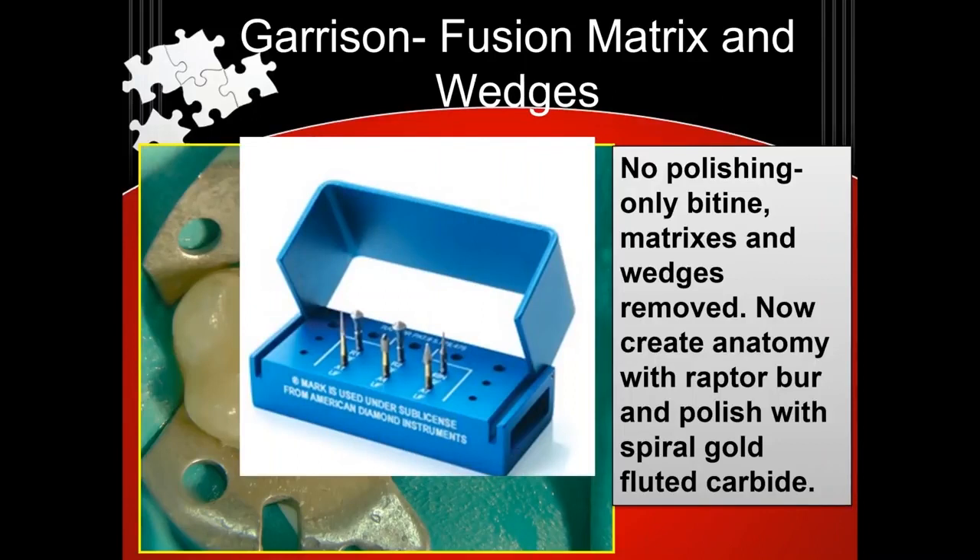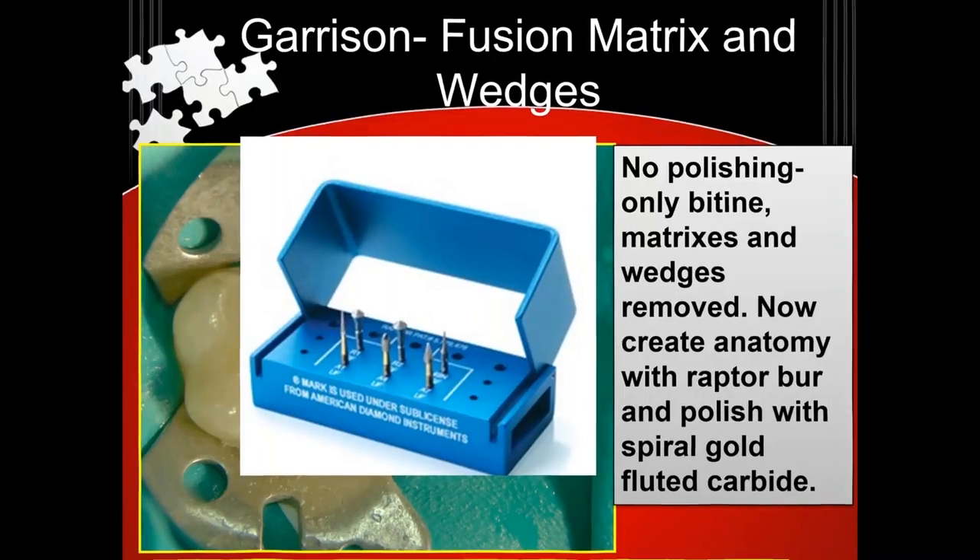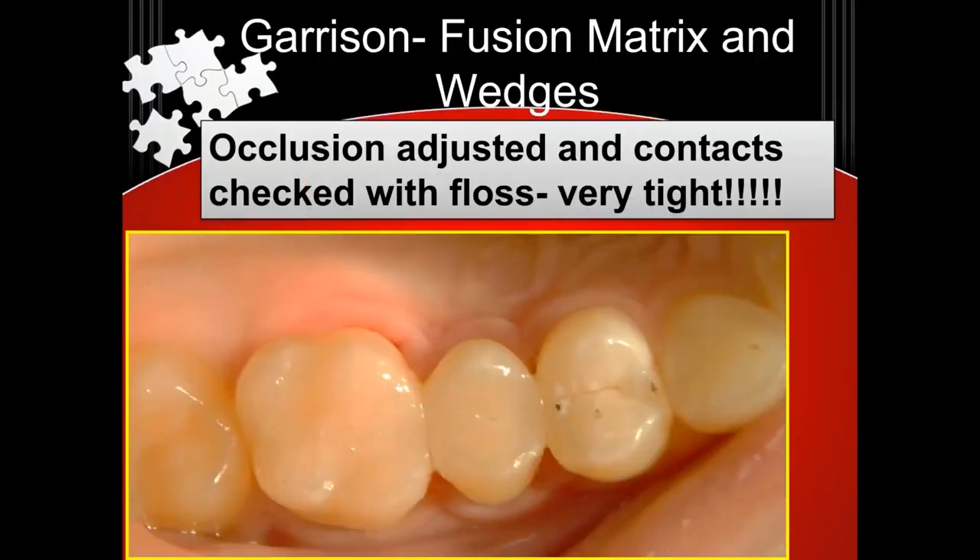And then you can check your occlusion. You have some very nice tight contacts and good contours. And I used to have, like everyone else, issues with contacts — I really don't anymore.